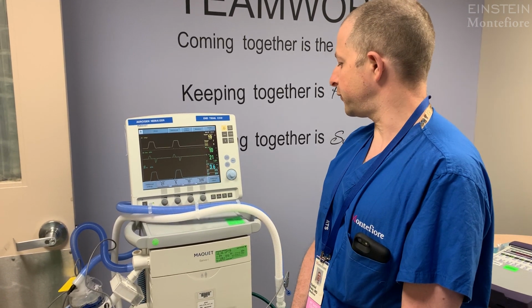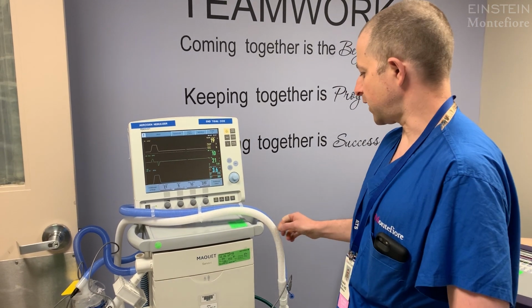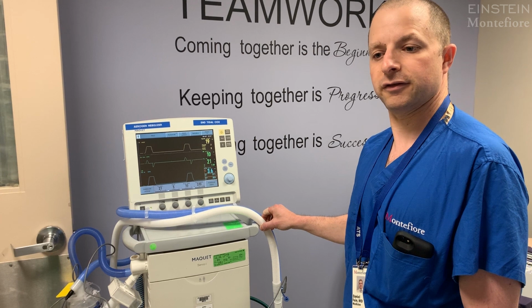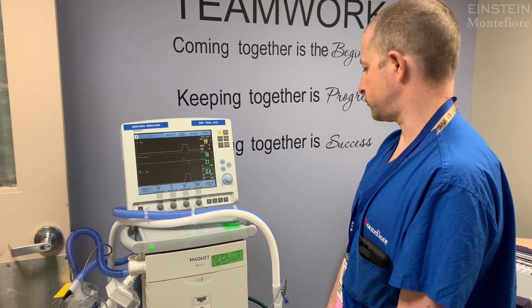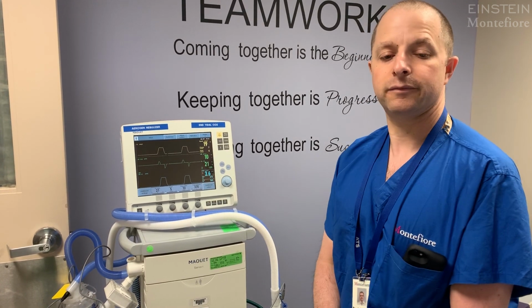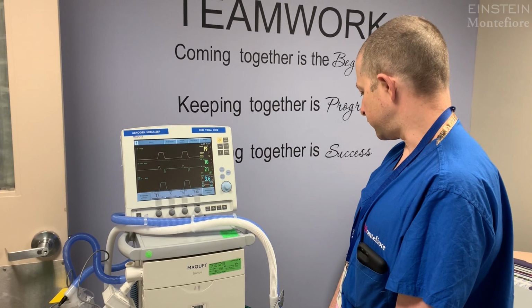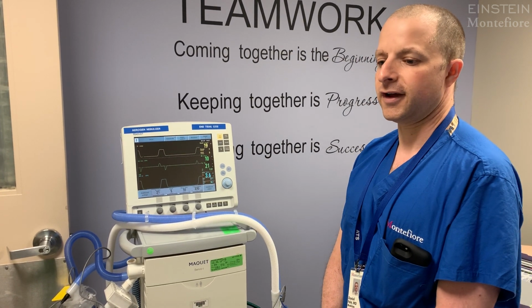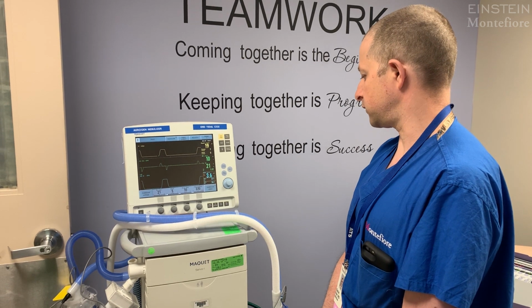So in this type of ventilator, what you'll see is that there's actually an inspiratory limb and an expiratory limb, so it's a closed system. And this is important during the COVID-19 pandemic in that the expiratory air from the patient is not theoretically going throughout the room.